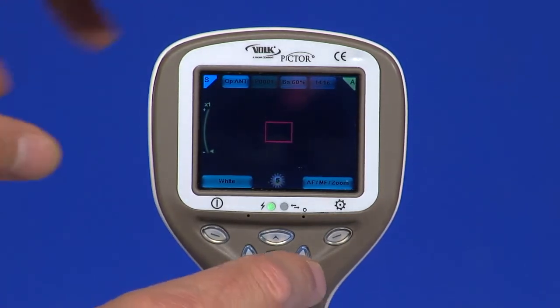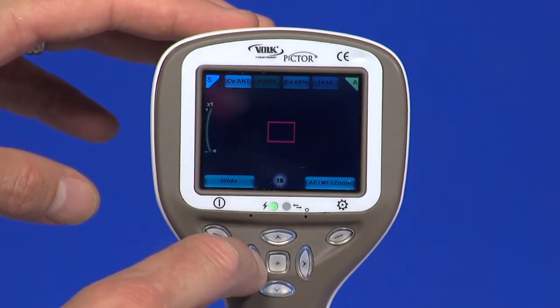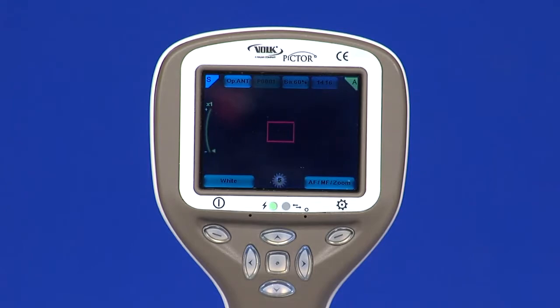Light is adjusted using the left and right arrow keys. There are ten brightness levels. The default value is five, and suitable illumination is typically between two and eight.